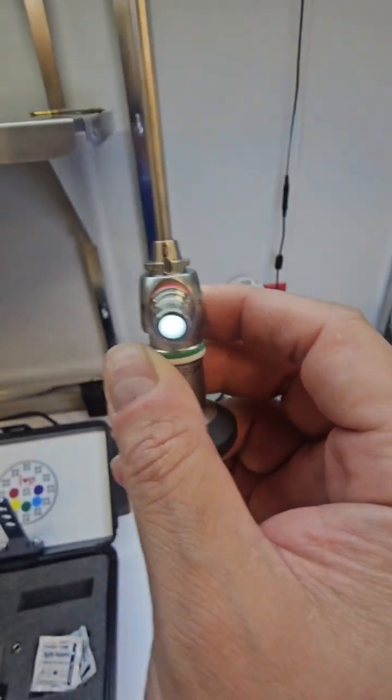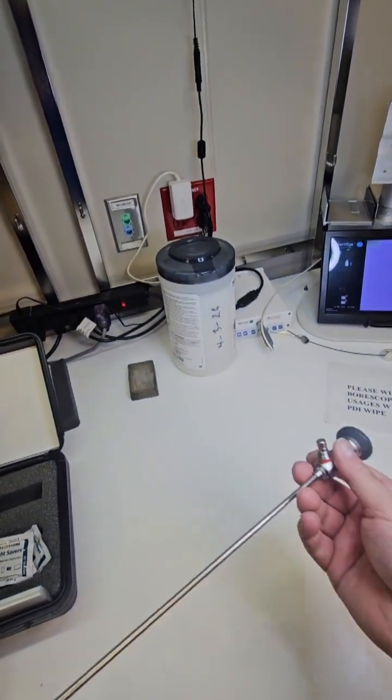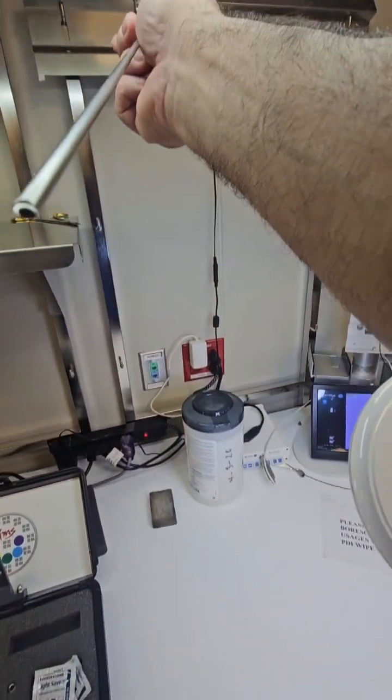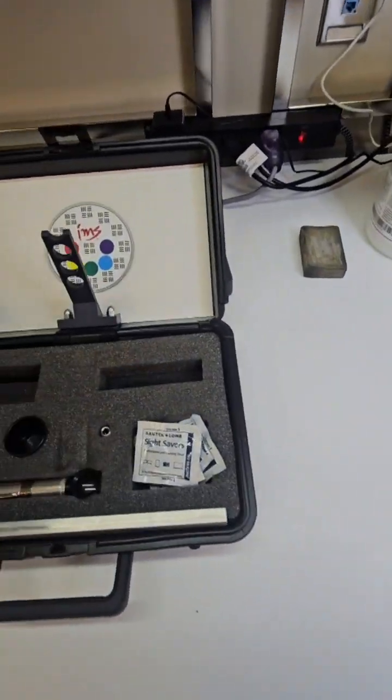You want to hold your endoscope up to a light source and look for those burnt out light fibers from the distal tip and the proximal end where the light post is at, to ensure that you're seeing a continuity and consistency with how the light looks.